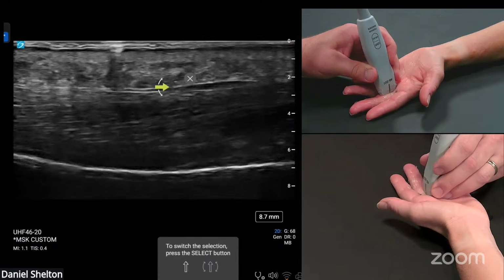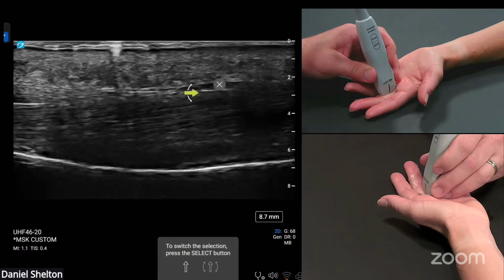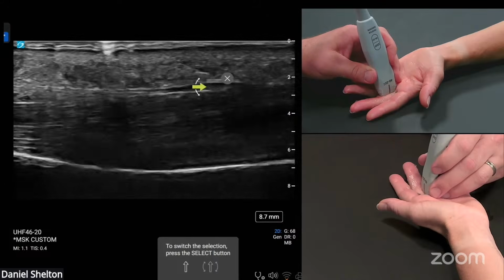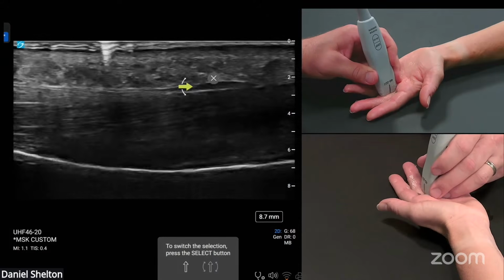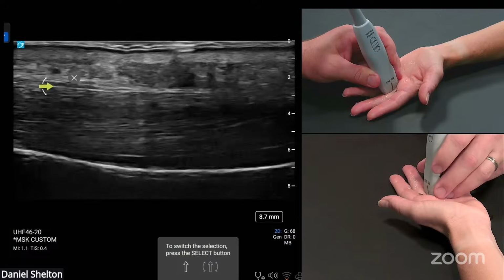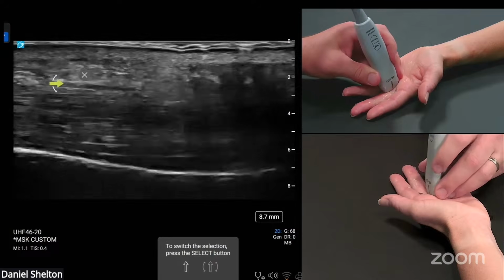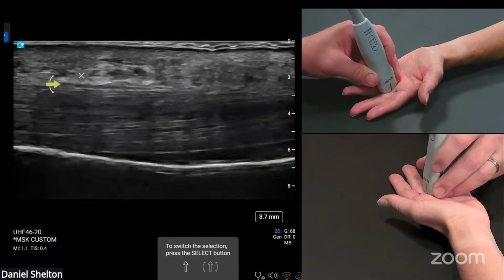And it's shaped a bit like an airplane wing in that one side's really, really broad. And there's more of a connective tissue thickening at the distal part of A2, and that's why it looks much thicker. And it kind of teardrops back proximally to a thinner margin, which I would say stops here because I can rock the sub-Q fat, and that sub-Q fat kind of goes down in towards the tendon at that point.